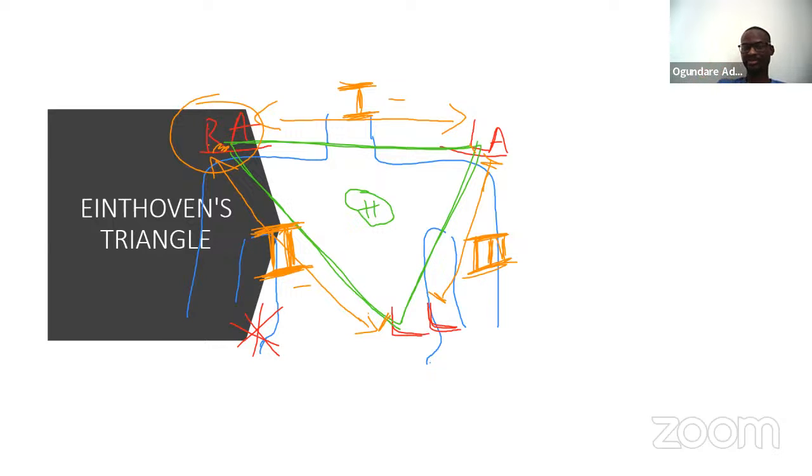The same thing is applicable if you have lead 2 and lead 3 involved in that nonsense, then you can know, okay, let me check the electrode I placed on my patient's left leg. Just be sure it's properly secured and it has not fallen off.